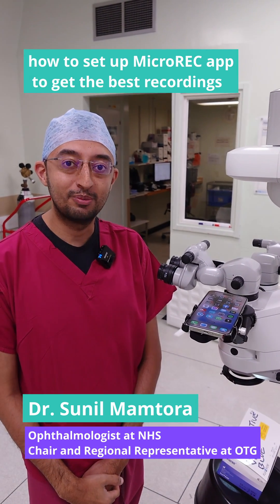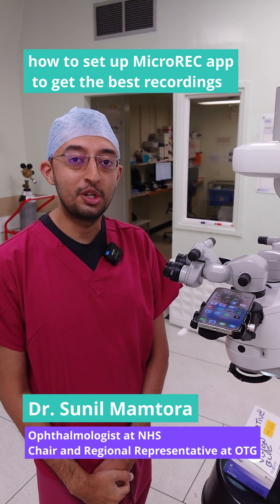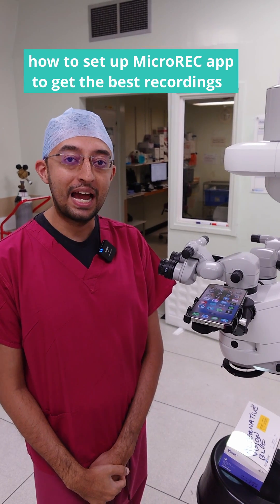Hi, my name is Dr. Sunil Mamtora and in this video I'm going to show you how to get the best recordings and how to make the most out of the MicroREC app.